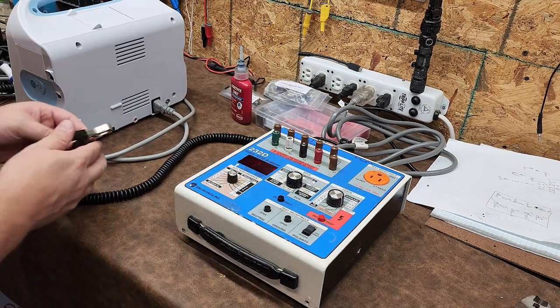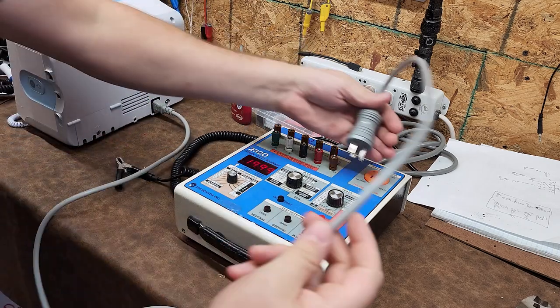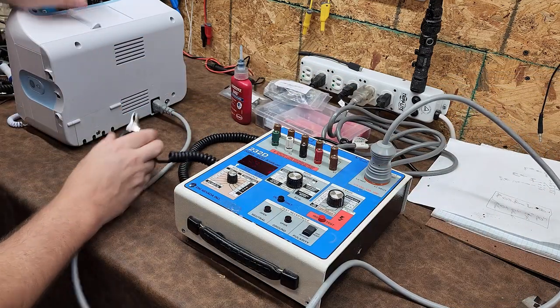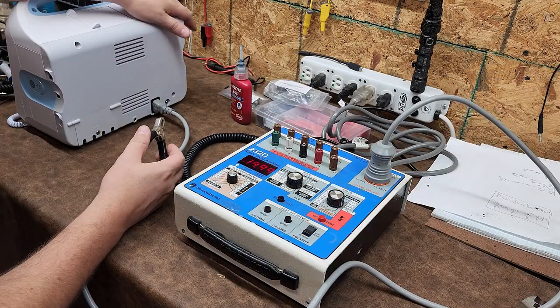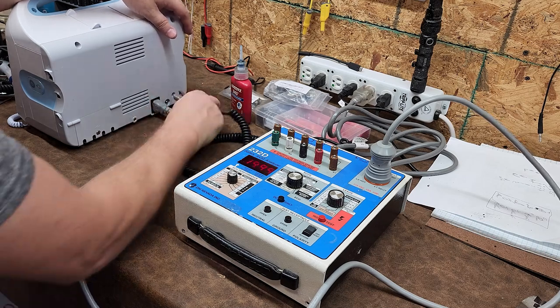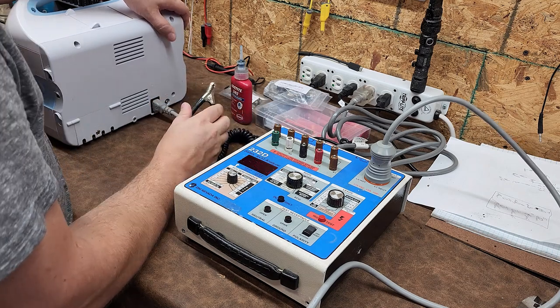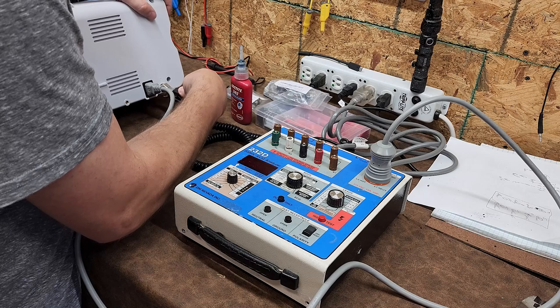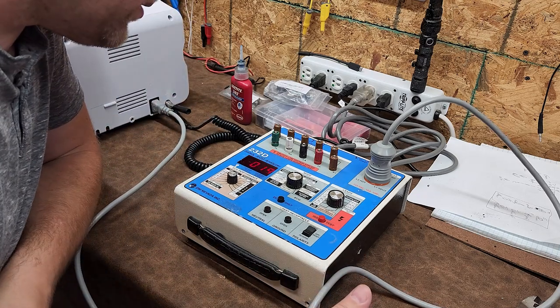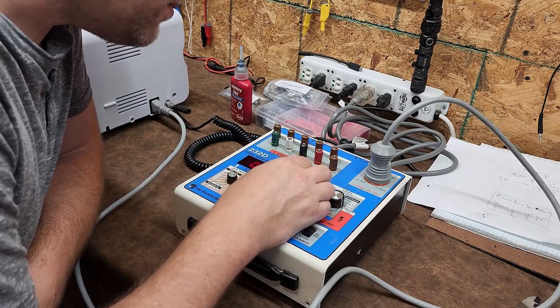For power cord resistance, I'm going to hook this up — I just so happen to have a patient monitor here. I have a fresh supply of Welch Allyn 6000 series Connex and I'm making some deals. I'm getting 19 milliohms.